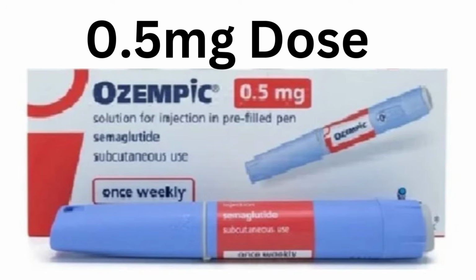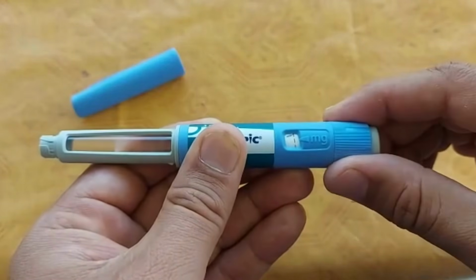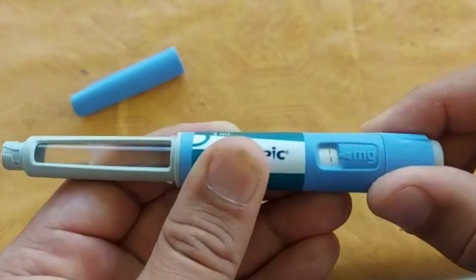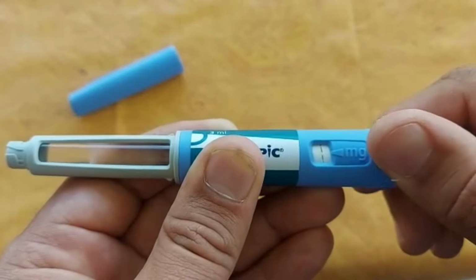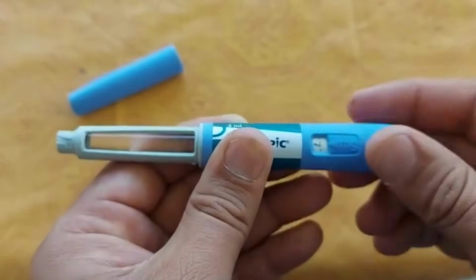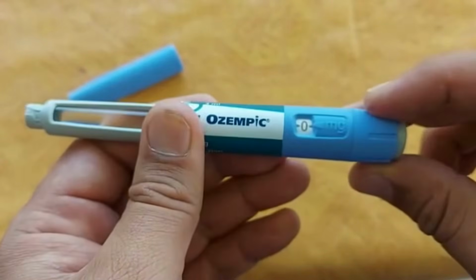Next up, the 0.5 milligrams Ozempic dose. Count from the first click or 0. Go up to 36 clicks and mark that point. These 36 clicks represent your 0.5 milligrams dose. Just like with the 0.25 milligrams dose, start from 0 or the first click and rotate the dose selector to 36 clicks for your weekly 0.5 milligrams dose.